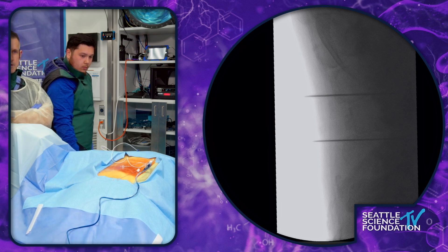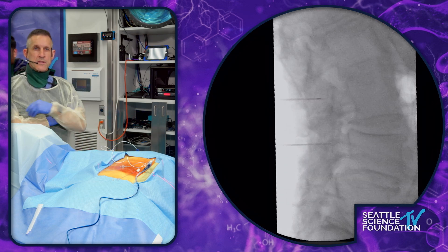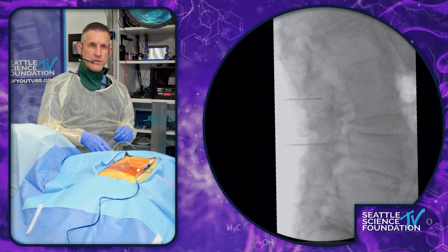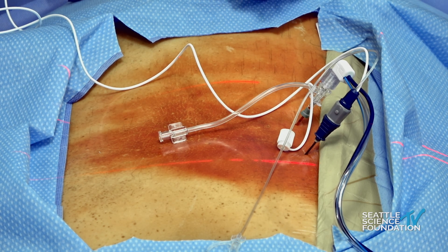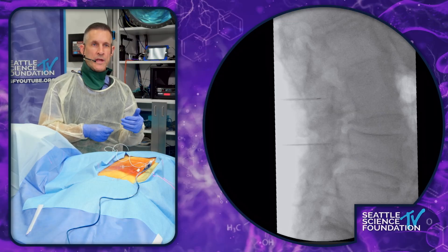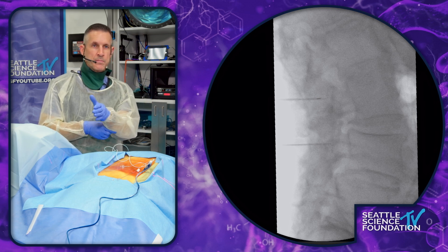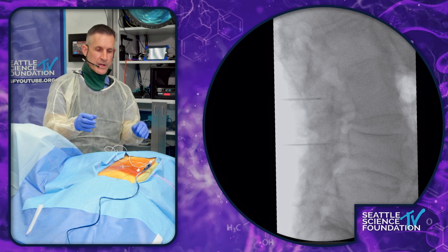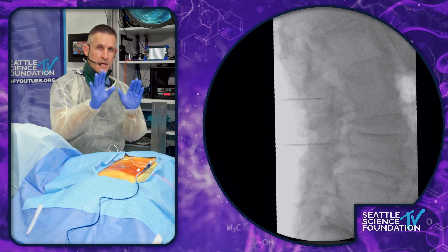Always great to have a great team around you — they're the important people here. We're just doing the driving. You can see especially the bottom one is laying right there on that facet joint itself. And then you can see the top one, the Coolief one. Remember we talked about how we want to be just a little bit behind the facet. You can see that it's a little bit behind the facet and I'm okay with that, because again the projection of about 30 percent distal beyond that tip is acceptable. You can see the foramen here — we're way remote from anything scary. We'll get all these placed, do the motor tests, and if the patient's awake do sensory testing — but this looks pretty good.